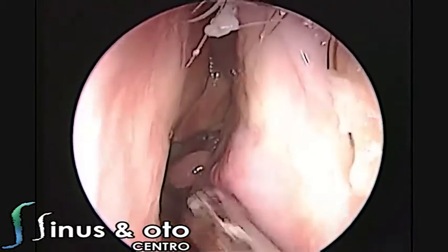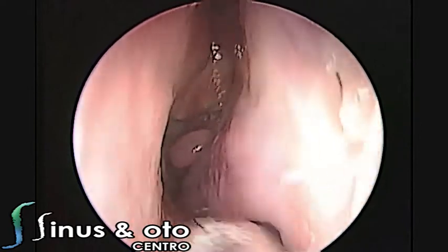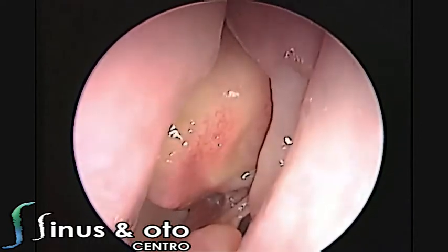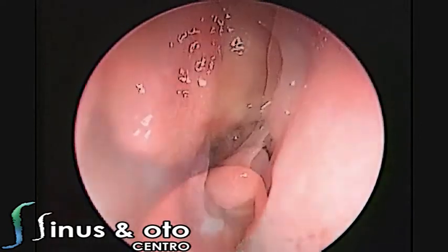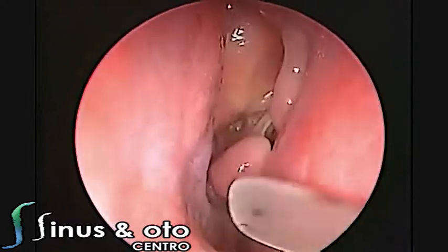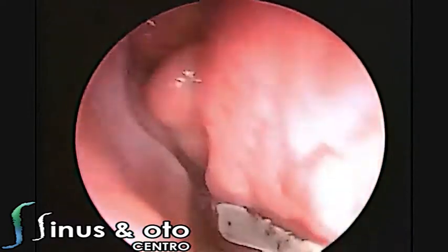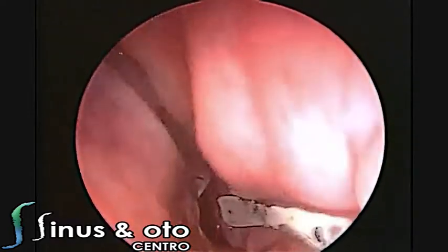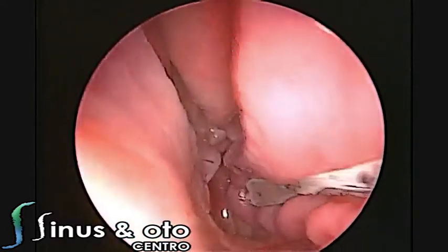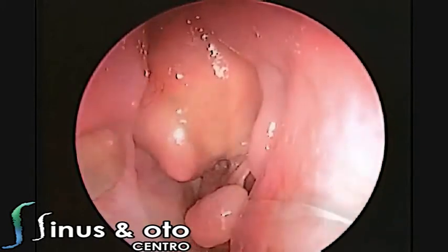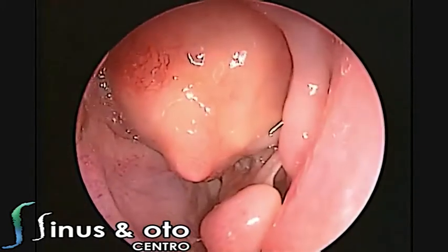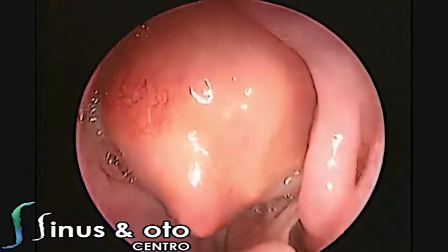This is the left side cavity — inferior turbinate, septum, and this is the lesion. This is a very interesting finding because the middle turbinate has been pushed down by the lesion. This is the inferior turbinate, and then this is the lesion.